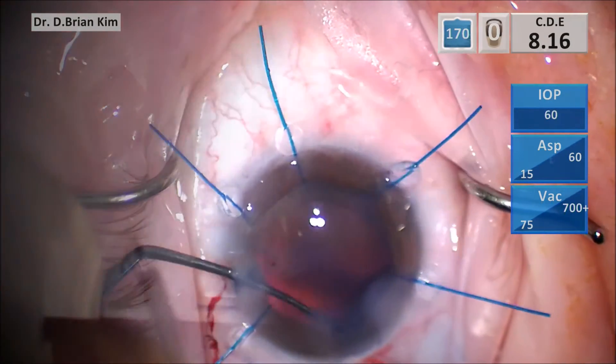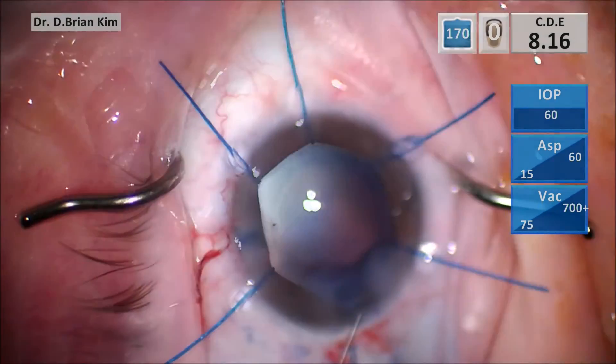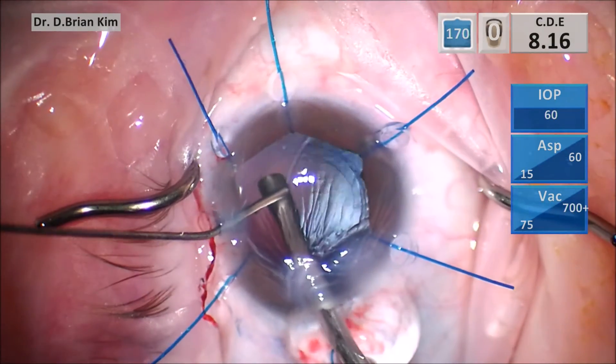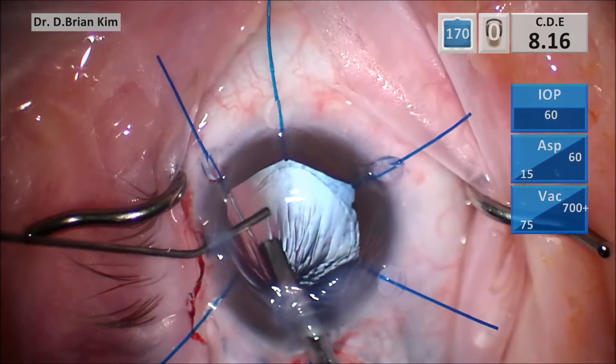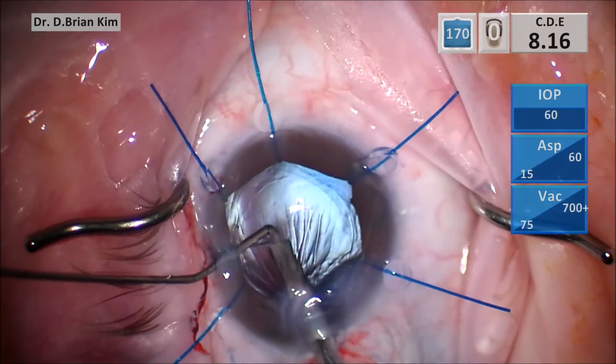I use the IA for the more anterior portion. This is how I load my CTR — you can see it goes in fairly easily. As I inject, I like to use my cannula to pop the tip of the distal portion of the CTR in.